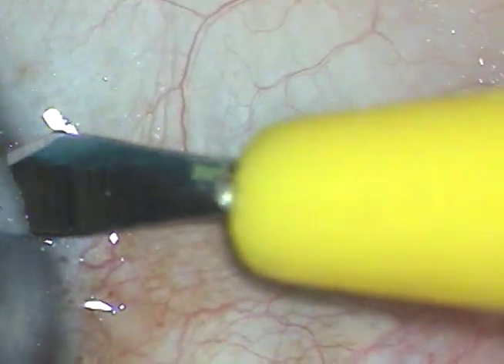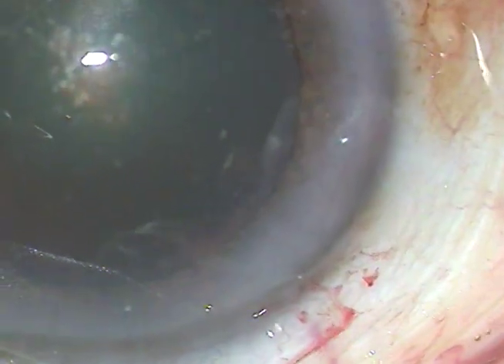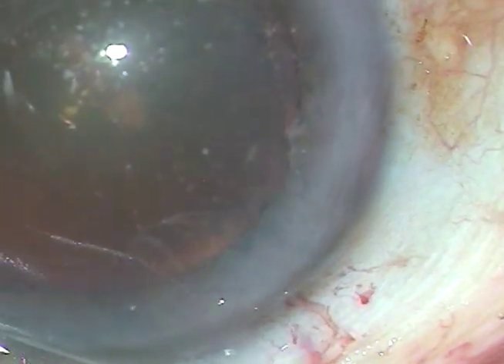This patient has a very soft cataract with hardly any nuclear sclerosis — grade 1. There is a posterior subcapsular cataract right at the center. The patient is under topical anesthesia and is moving his eye a lot.